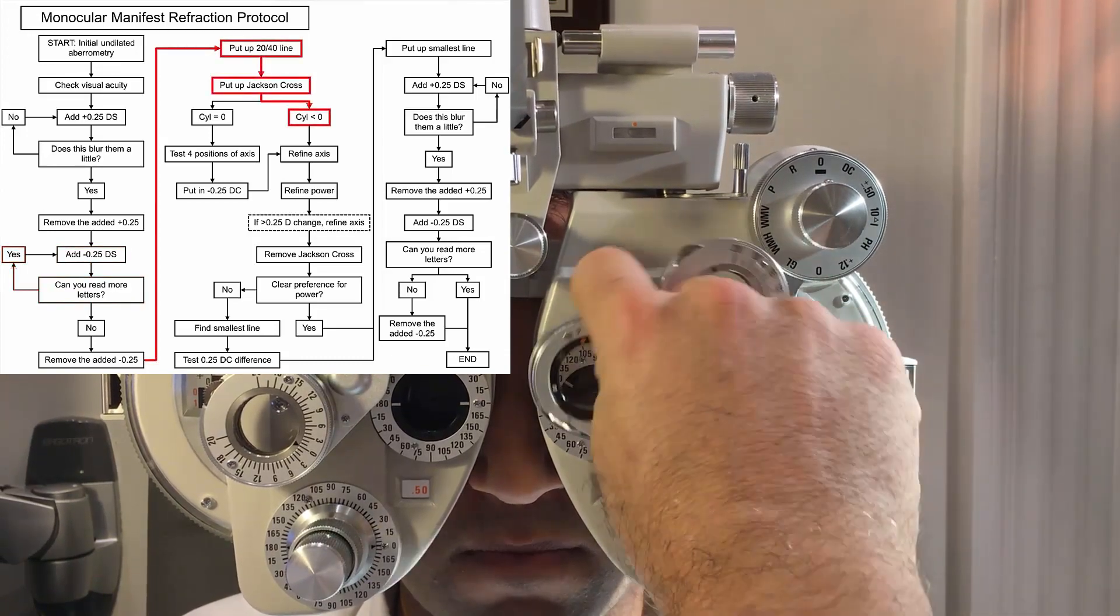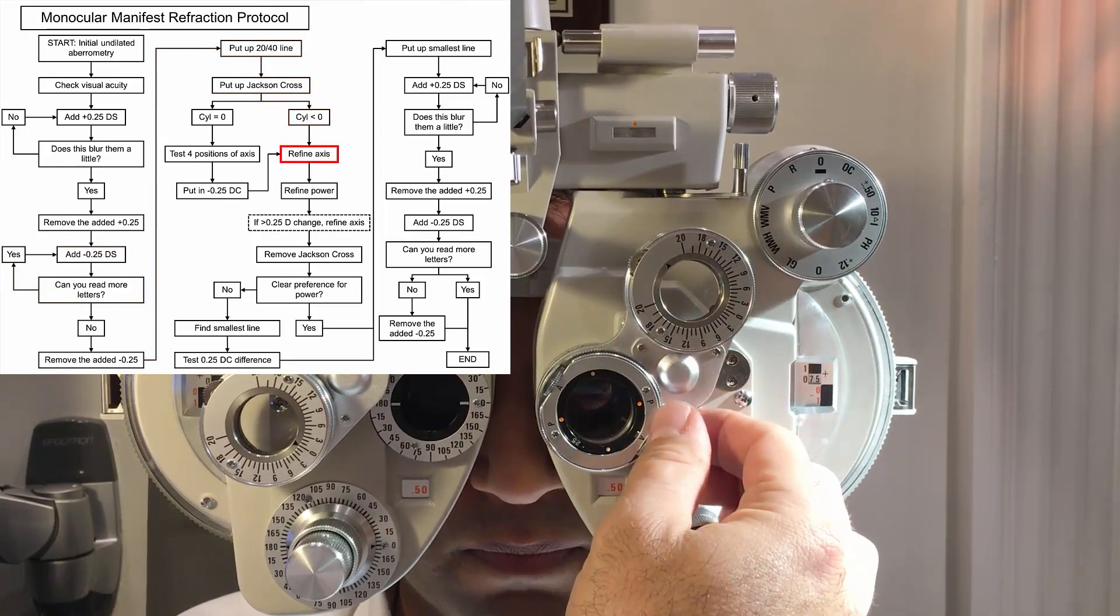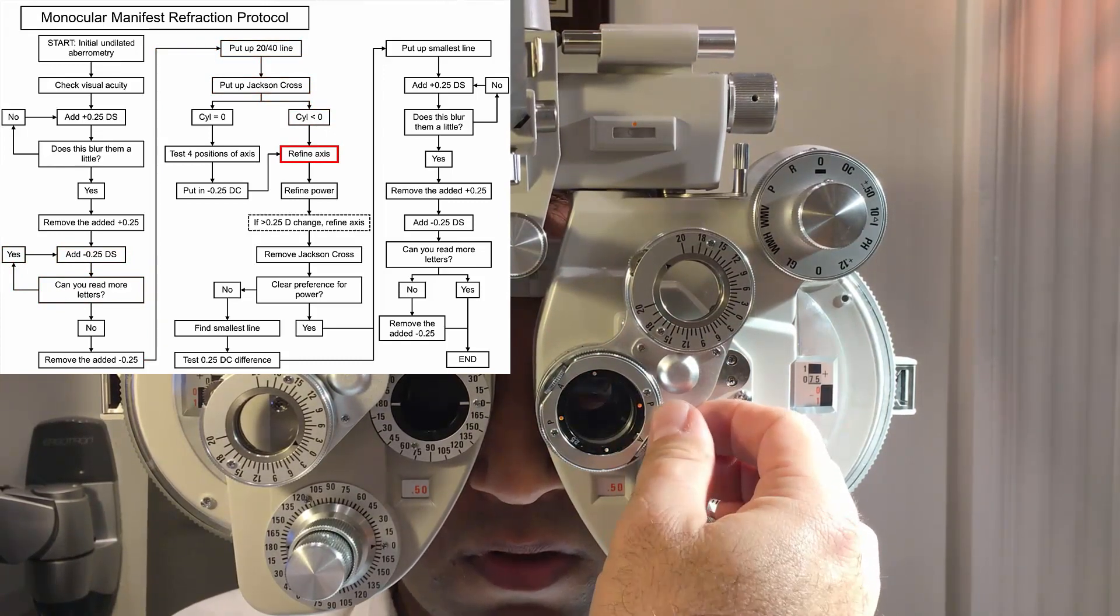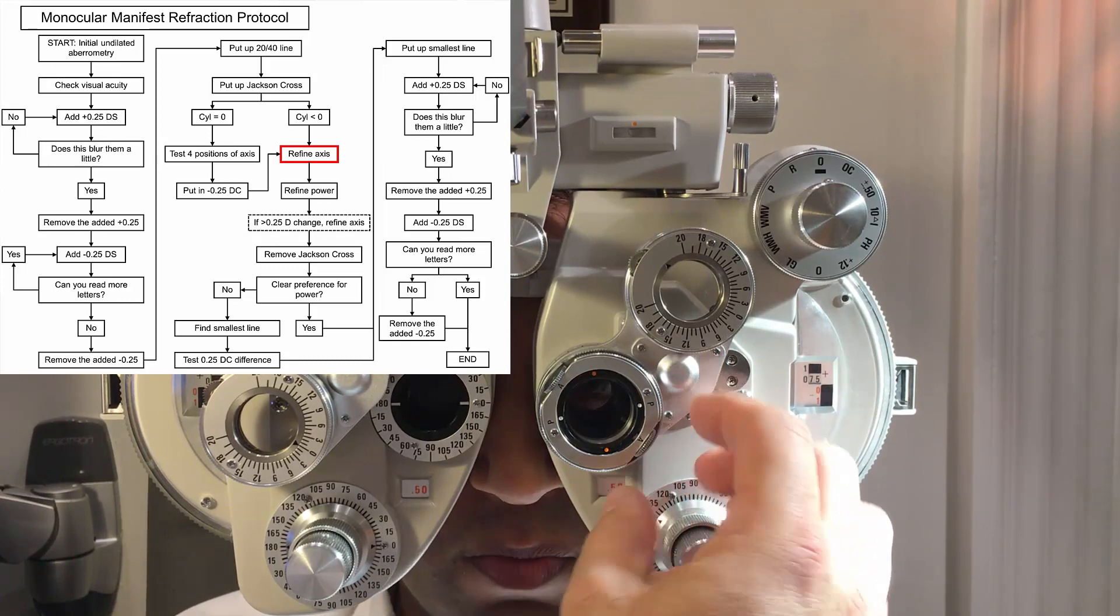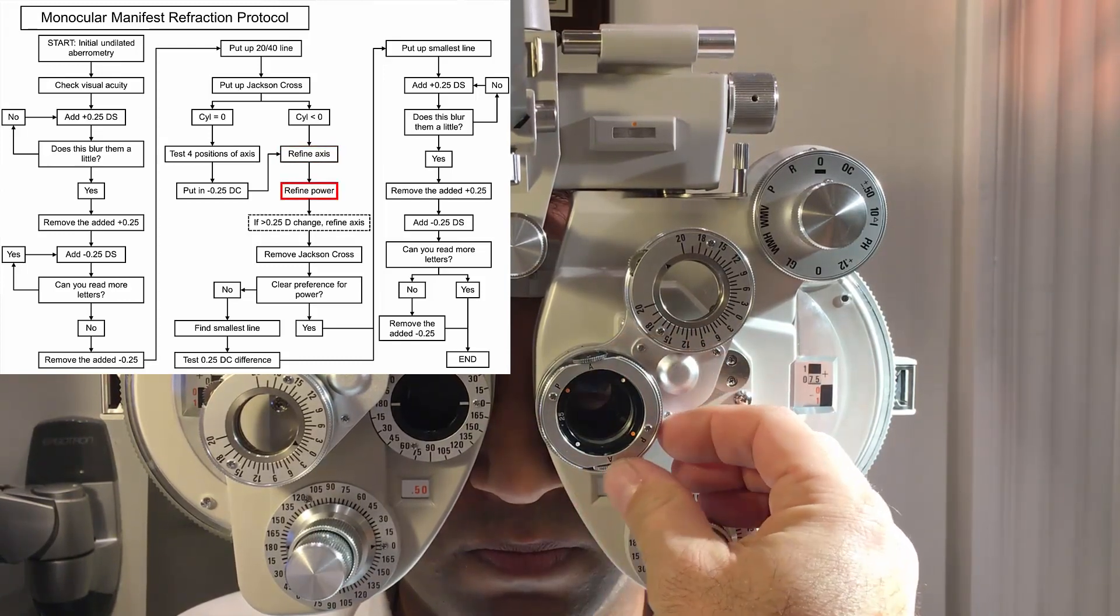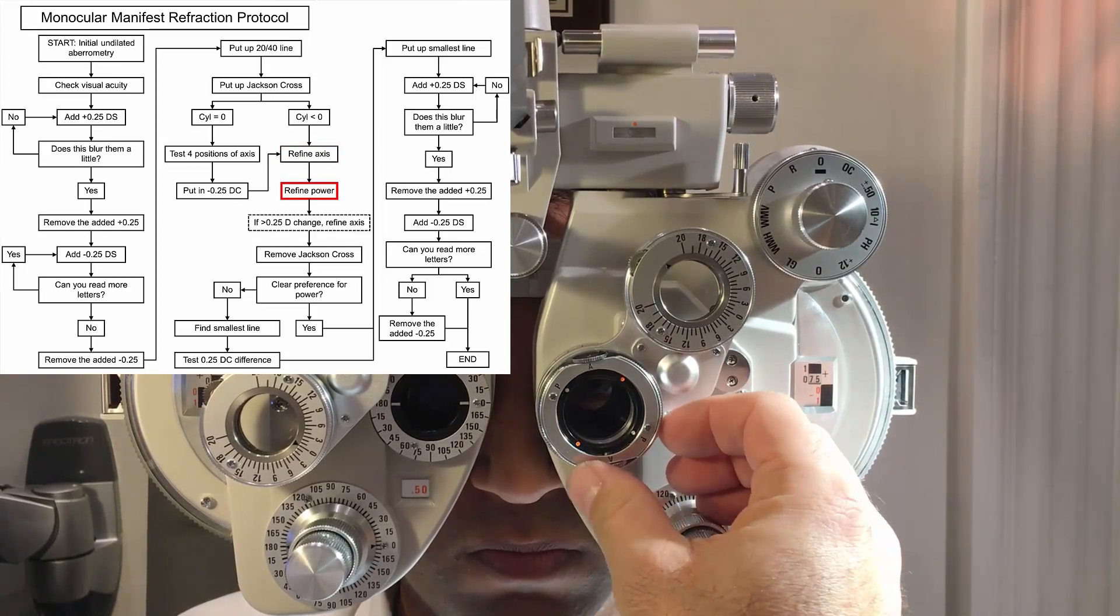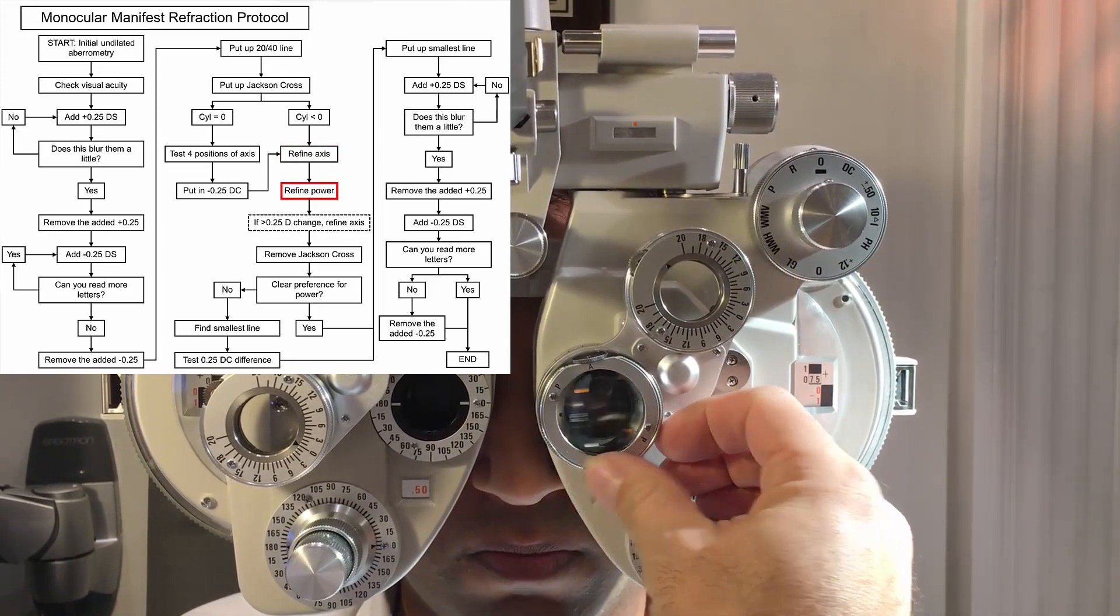Looking at the O where the arrow is, the edges are sharper with one or two. One, two, the same. Similar. What about three or four? Four. Five, six. Five, six, a little bit better.